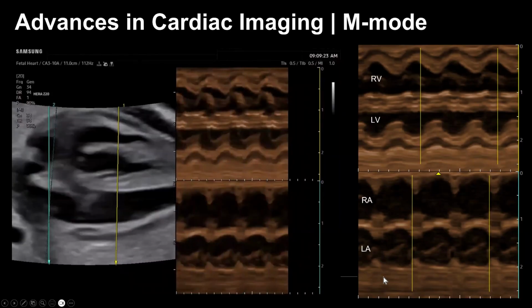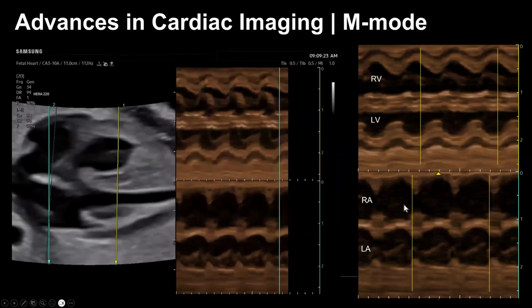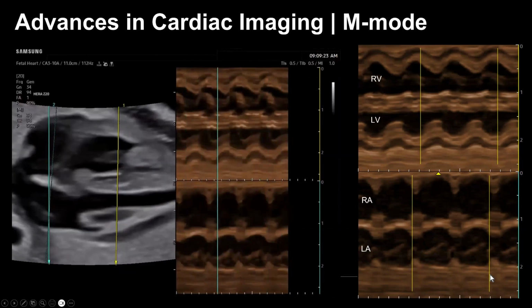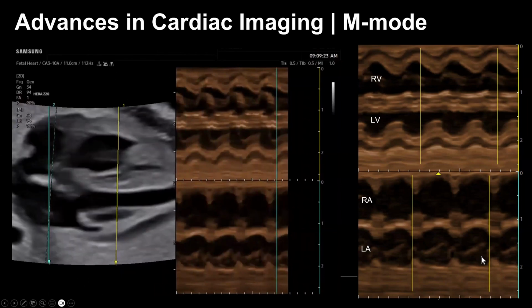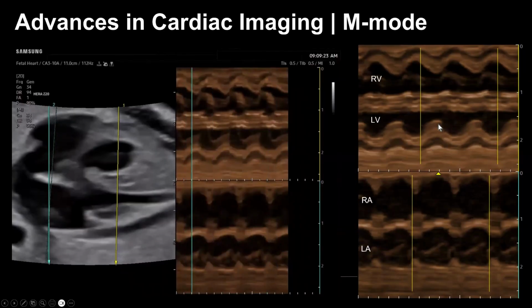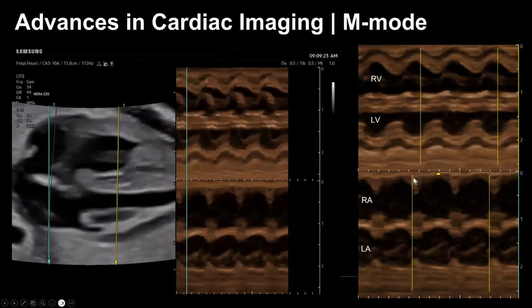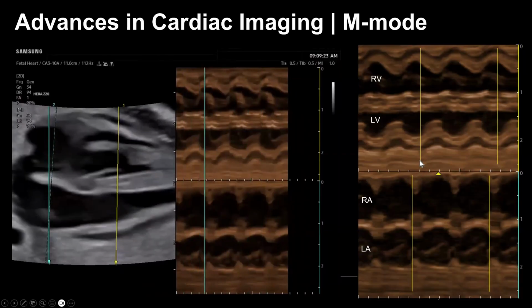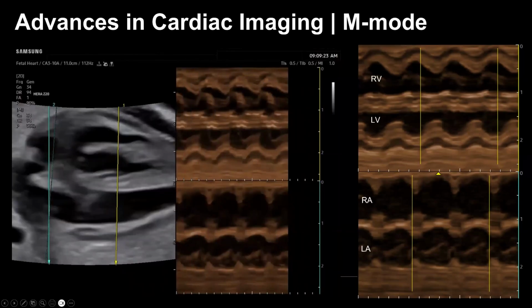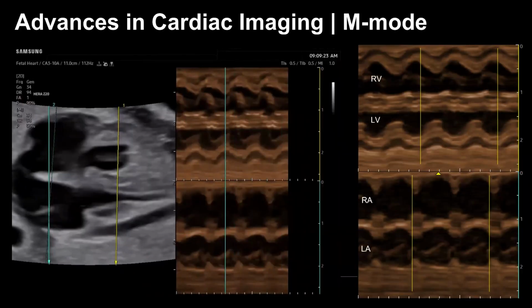And this is really important, in particular when you look at the atrial contractions. We can look at two atrial contractions and take the measurement of the heart rate between them, and then in the same cardiac cycles, we can identify the ventricular contractions. They're going to be shifted in time in relationship to the contraction of the atria. Here you can see that the measurement should be pretty much the same, and this way you can demonstrate not just the heart rate, but also the rhythm.